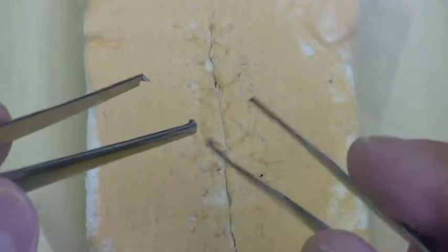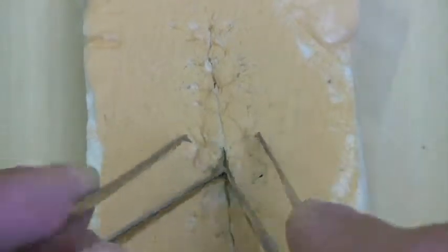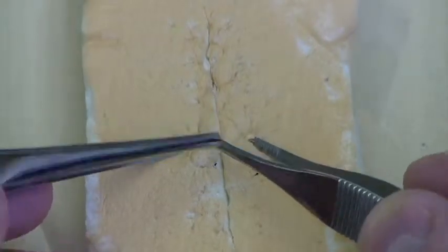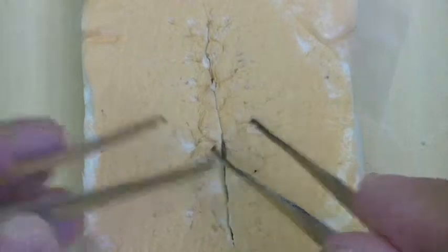A vertical mattress stitch is a nice stitch to throw because it closely approximates the skin edges. It also helps to evert the skin edges, which means bring them out like this. That provides good wound healing. You don't want the skin edges to be folded in because then it's not going to heal as well.